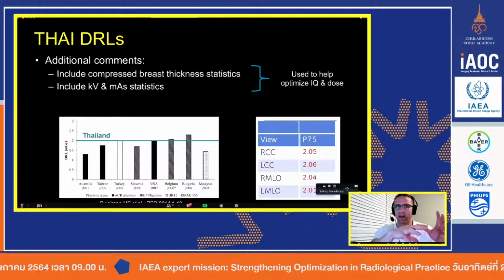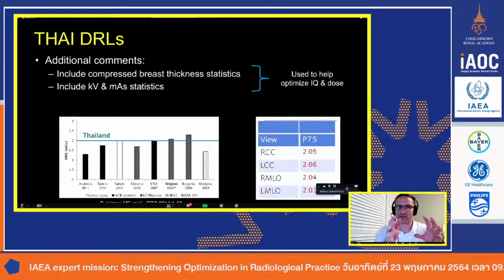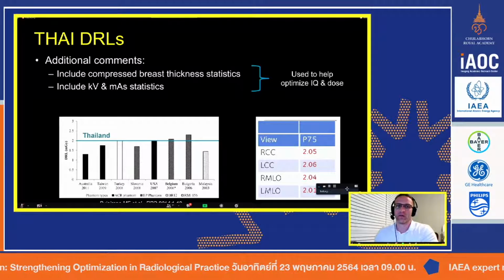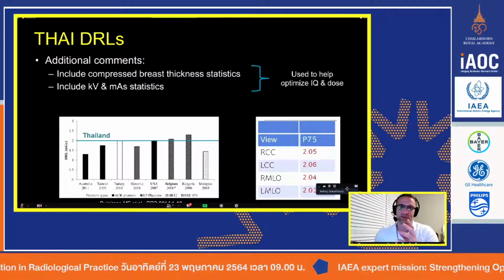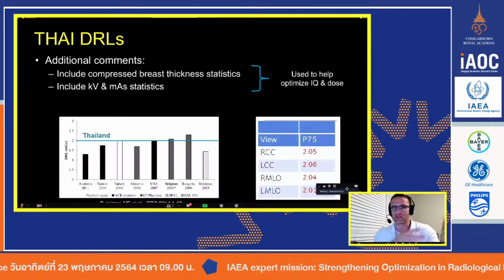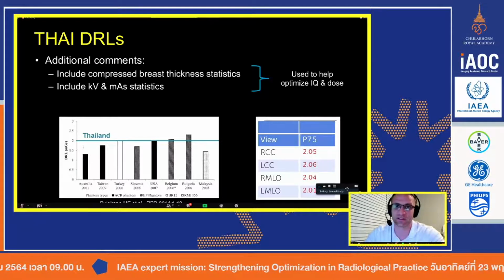Then that data can be brought together. You can compare that to all the dose data that comes in from their software, and then calculate the DRL from there. But in the future, if you have the ability to collect simply the images, where the image goes off and you collect a certain percentage of those for calculation, then yes, you can really do some high level statistics.